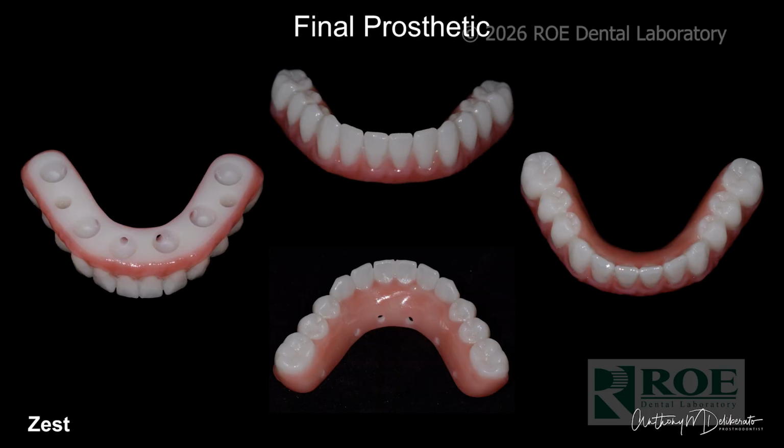And for this case, because we're not using SRA abutments and we're not picking up the locators, I'm taking an impression directly to the implant fixtures. So there's no intermediate abutment in this case like we would on a conventional screw retained case where we put MUAs or SRA abutments. And this is the final prosthetic where we'll do the pickup outside of the mouth.